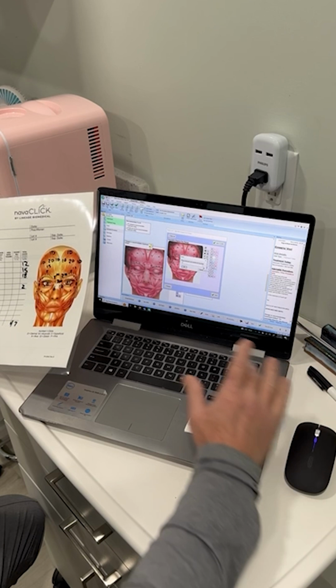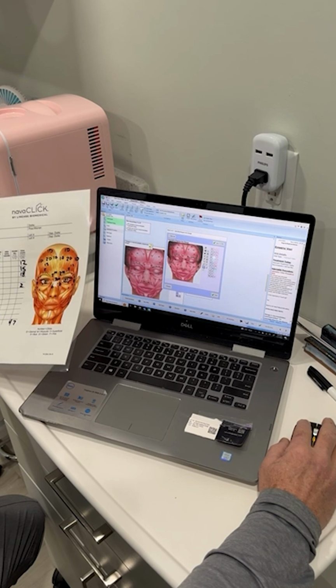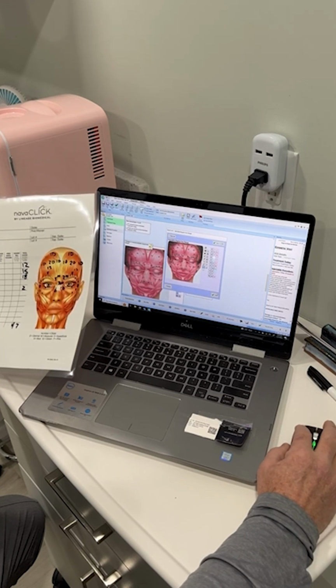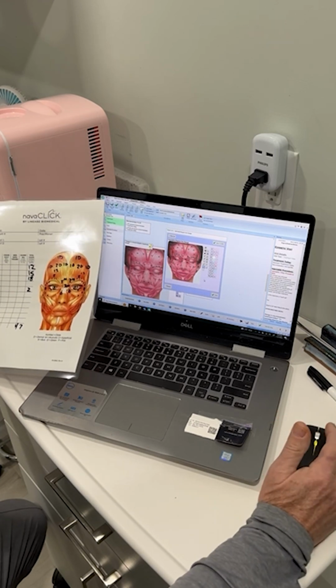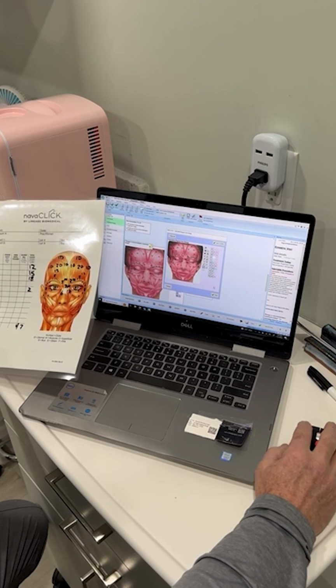And then I do a 9 on each of my crow's feet, 9, 9, and then a 2 in the nasalis, or bunny lines, right there. And then my charting is complete. It tells my other practitioners what I've done exactly. They should be able to follow this without any issues. It tells me what I did. If I like that, I can repeat it. If I don't like it, I can tweak it in any way I need to.